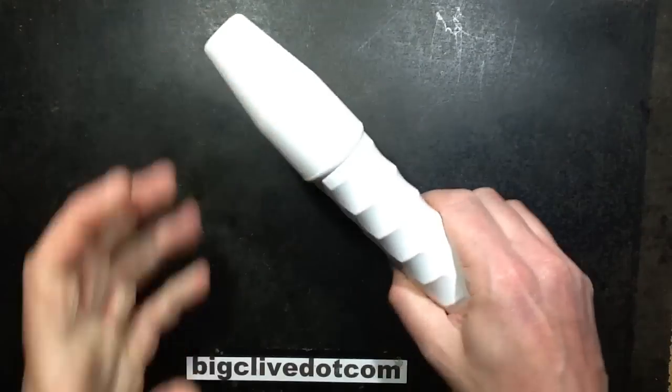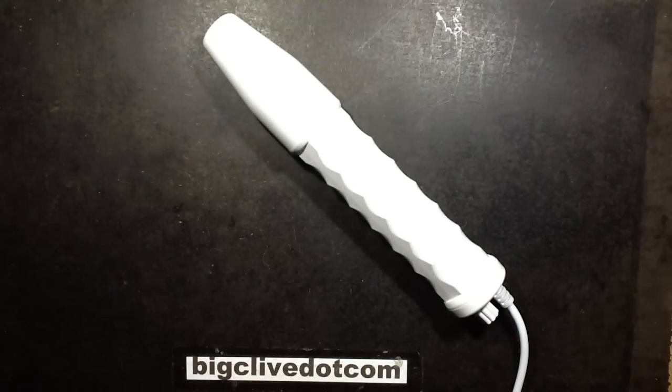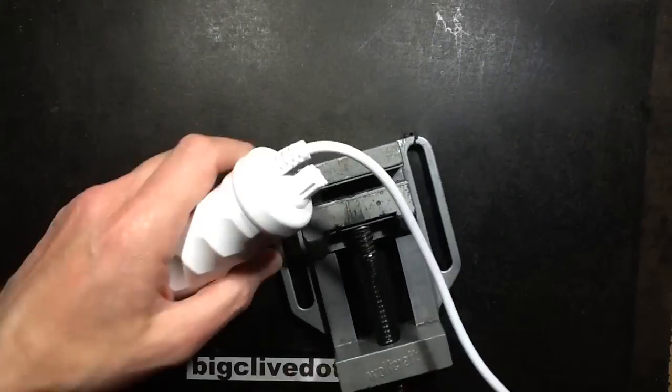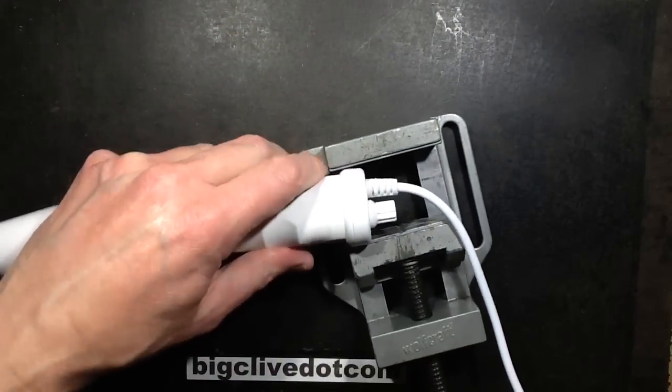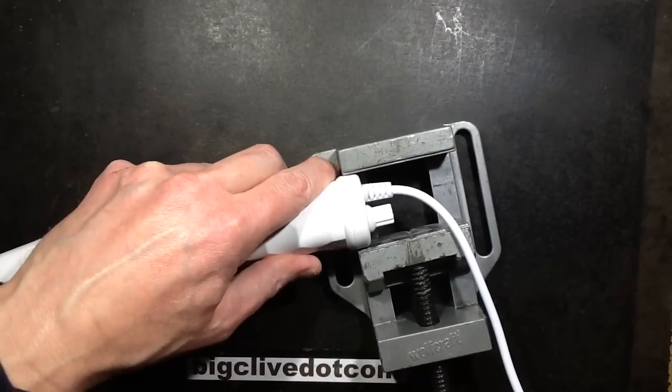Lovely. I can imagine the doctor turning up with that. So let's see if I can break the seal on this. I don't know if it's just clipped in or if it's glued. I guess we'll find out shortly.